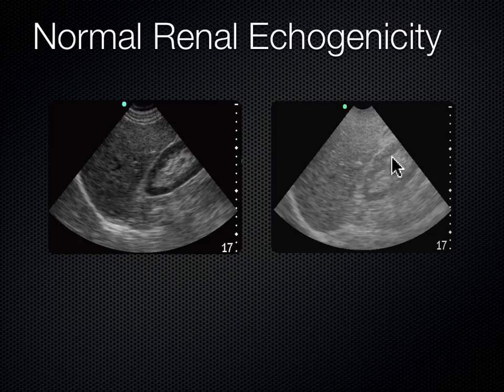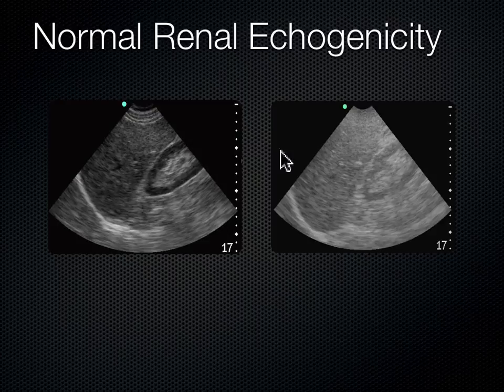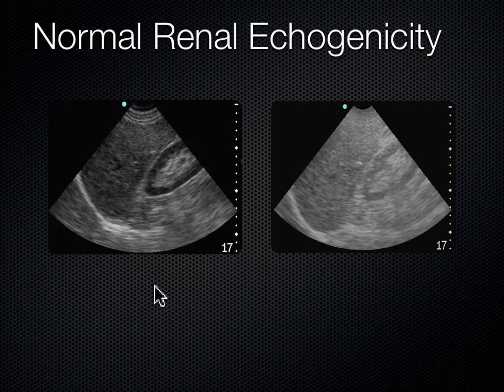In the over-gained image, the cortex and liver wash out together and it's hard to tell that the cortex is less echogenic than the liver. That's why echogenicity of the renal cortex relative to the liver is a useful measure of gain — I know my gain is set right when the kidney's cortex looks darker than the liver or spleen.